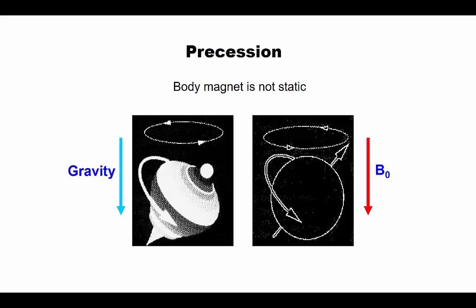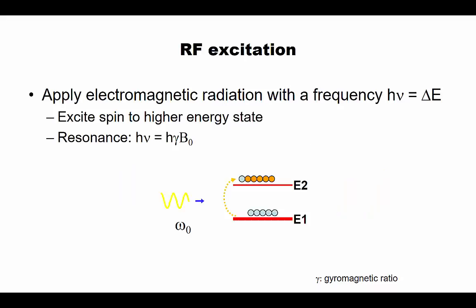As the nuclear magnets are quantized, the direction can be either up or down. Depending on the directions, under a strong magnetic field, there can be two populations of magnets. If they are different in energy level, by applying electromagnetic wave, we can excite the lower energy magnet into the higher energy level. This is quite similar to excitation of an electron from a lower to a higher energy level. What range of light did we use for the electronic transition? Do you remember? It was either in UV or visible light range.